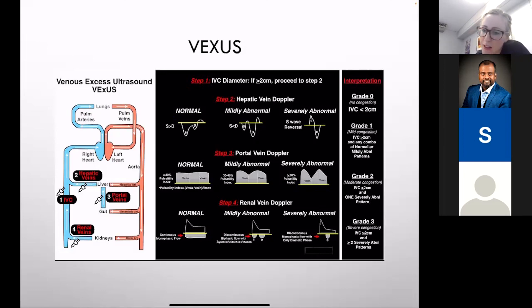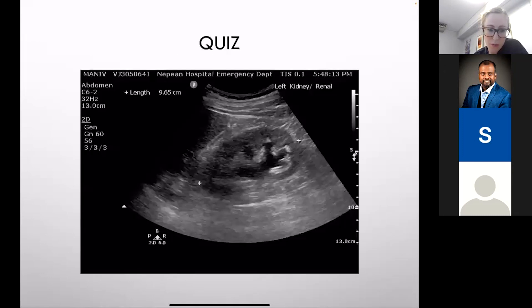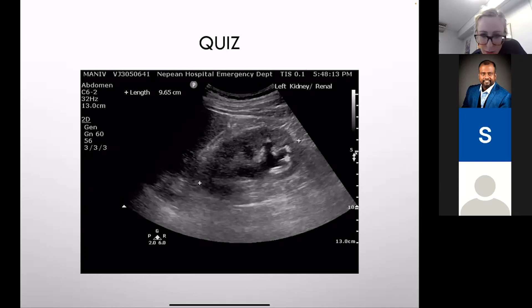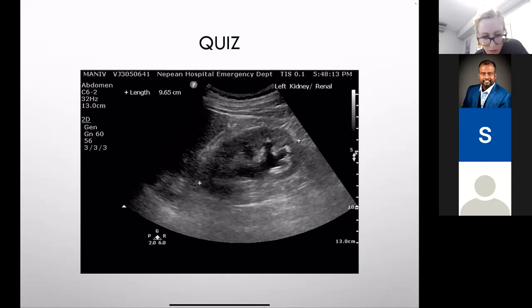Thanks, Vijay. Hattam notes that VEXUS is not validated in critical illness — only in post-cardiac surgery. Final case: what do you think about this image? It looks like moderate hydronephrosis — the papillae are starting to flip. Cortical thickness seems reasonably thick. In practice, radiologists sometimes use 'mild to moderate' or 'moderate to severe' terminology because some areas look different within the same kidney. That's not uncommon.